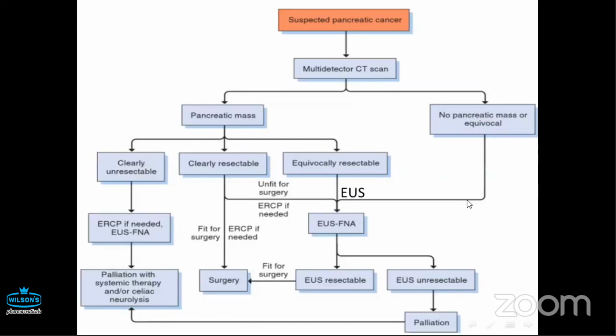I have a comment and a question for you. The question that we get asked by our surgical colleagues is about the conventional or unconventional arterial anatomy. Obviously, I can see in your hand, despite EUS being a 2D modality, you're able to accurately stage the cancer. So how confidently can you answer the question whether a patient has a conventional arterial anatomy or not? For example, the cases where they have a replaced right hepatic artery. Another question that we've learned over the years is whether the patient has median arcuate ligament syndrome, celiac artery stenosis or not. Those are important considerations when the information is being provided to surgical colleagues, especially when they're making a decision for a very high risk surgical modality.